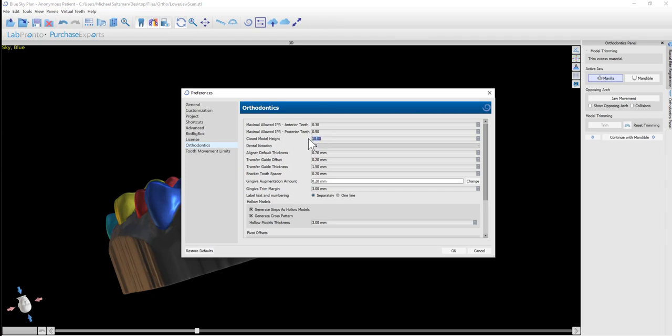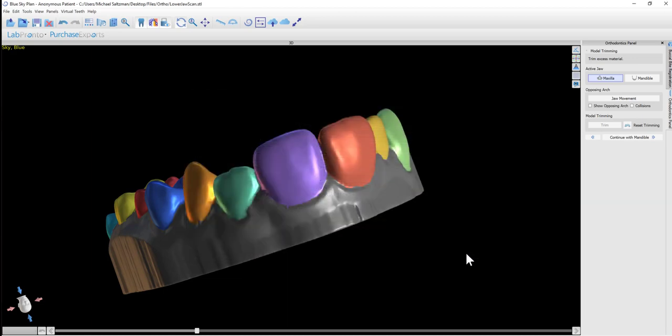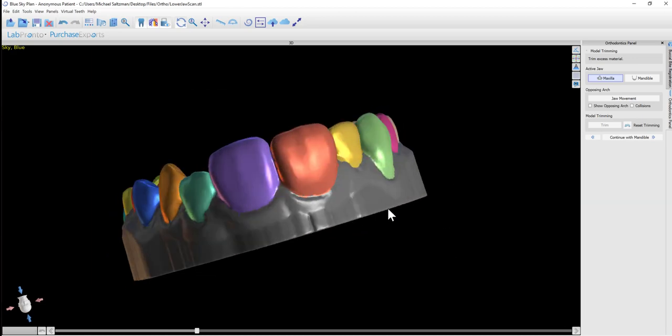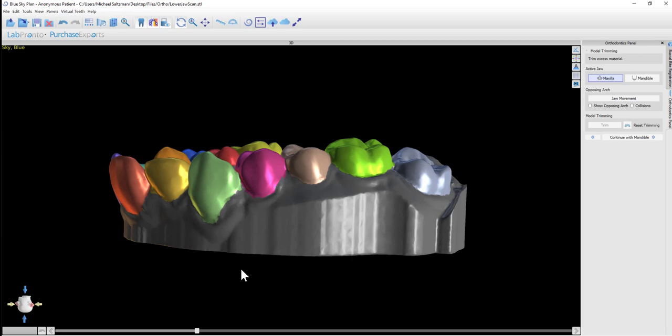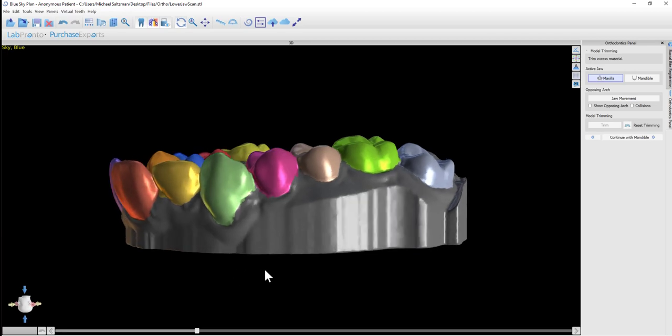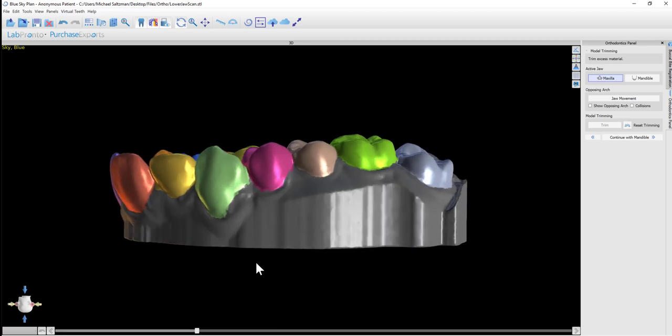Even if the closed model height is less than the trim curve, the model will still be the height of the trim curve, but it won't be anything more than that. That's an option you can change if you want, but in most situations, there's no need.